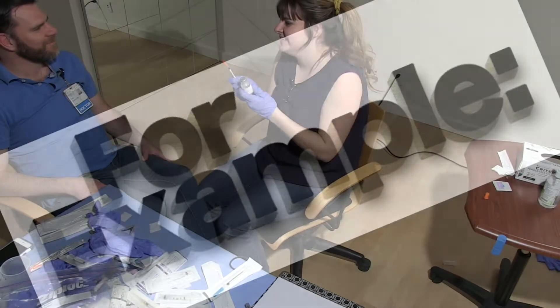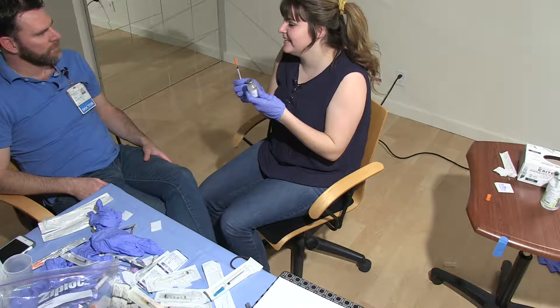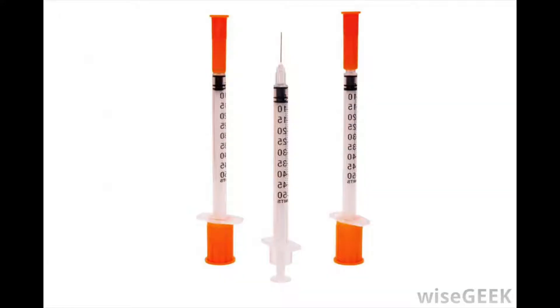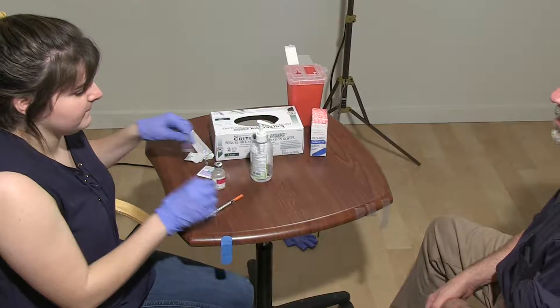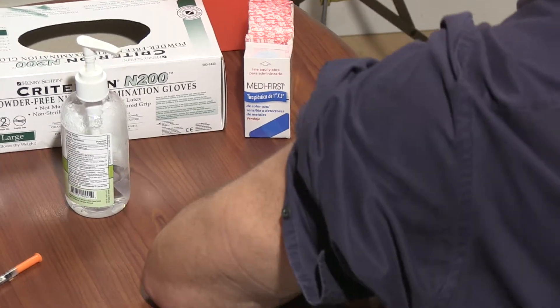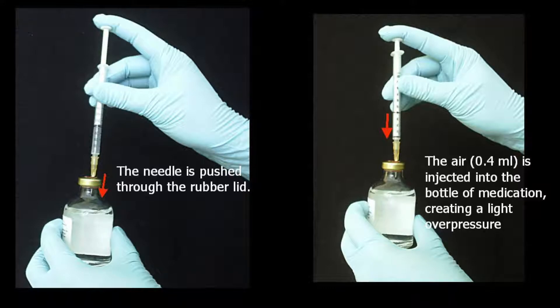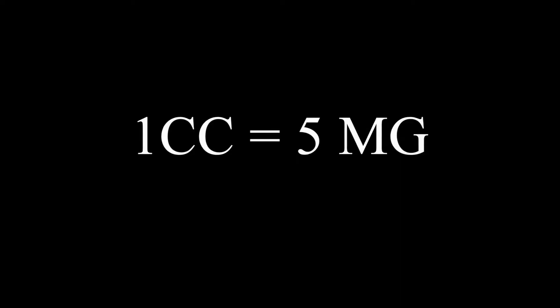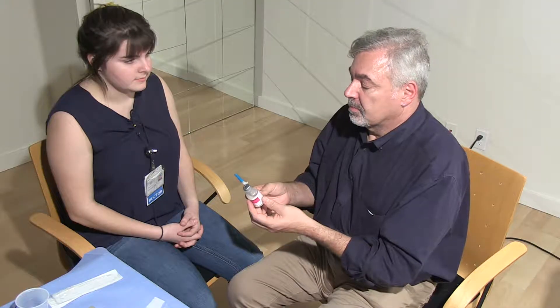For example, I have an order to give Reglan 5 mg sub-Q times 1 from Dr. Smith. I've selected a bottle of Reglan labeled 10 mg per 2 mLs. I've selected a 5/8 inch 27 gauge needle and a 1 cc Luer-lock syringe. I've opened an alcohol wipe to clean the med bottle, then assembled the needle and syringe. After a final cleaning of the med bottle stopper, I am withdrawing 1 cc of air into the needle to inject into the med bottle. I am now withdrawing 1 cc of Reglan, which is equal to 5 mg. After removing any air from the syringe, I will recap the needle and present to my provider for review.